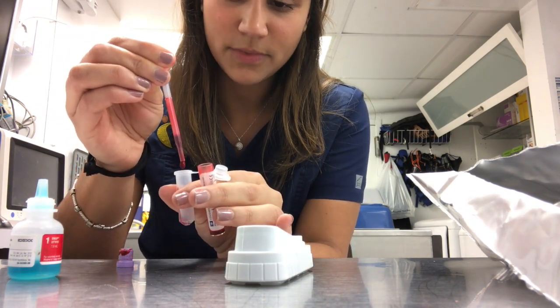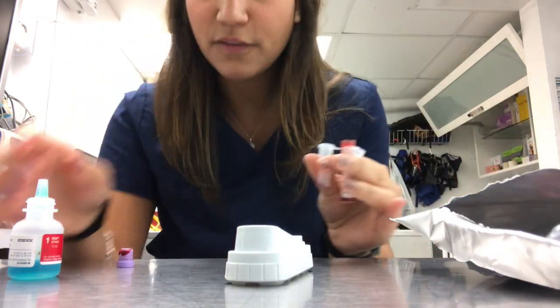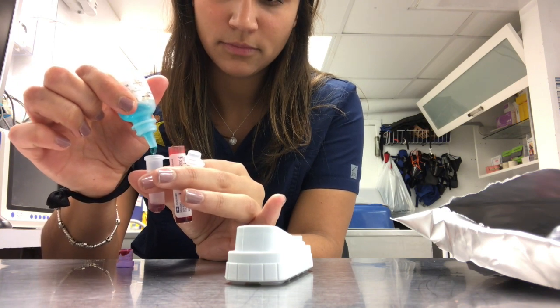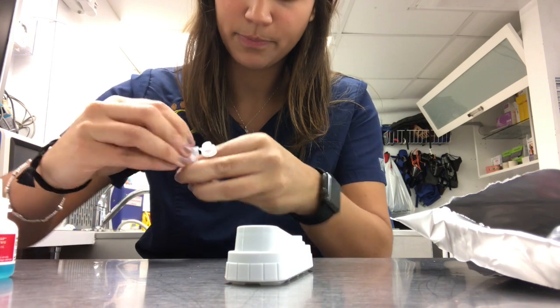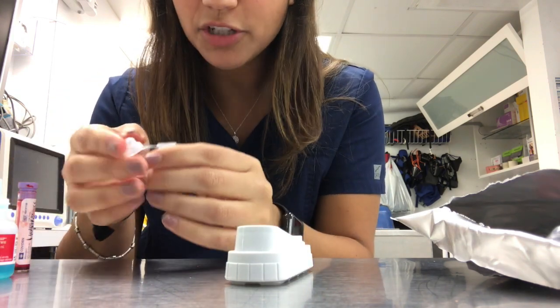We have 1, 2, 3. Perfect. And then 4 drops of our conjugate will go in here. Perfect. And I will cap it off and gently invert it.